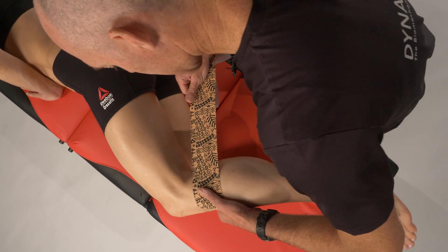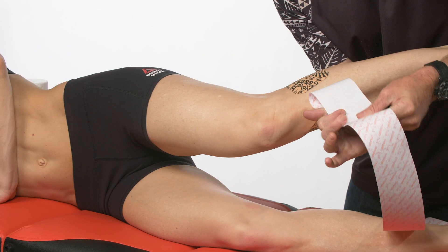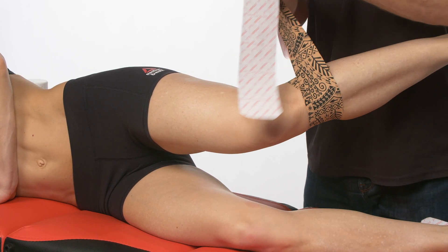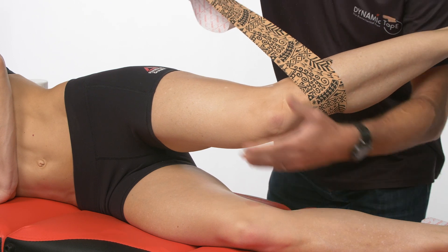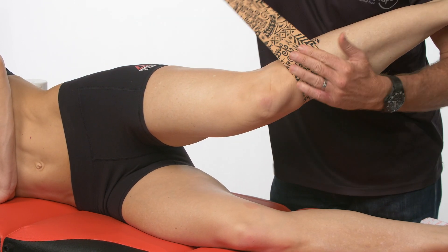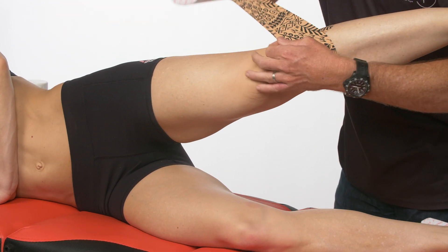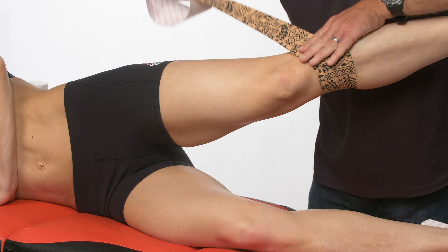We're then going to bring the leg up, get our anchor point on, sweep around with our tension on to create that force closure. We can then come in underneath, angling this a little more to run this up that iliotibial band.